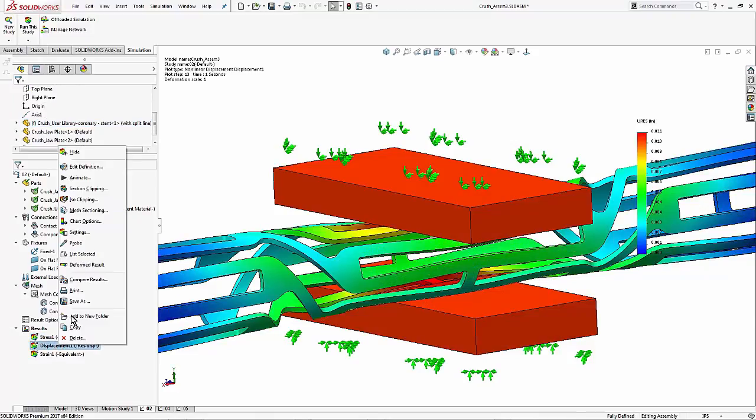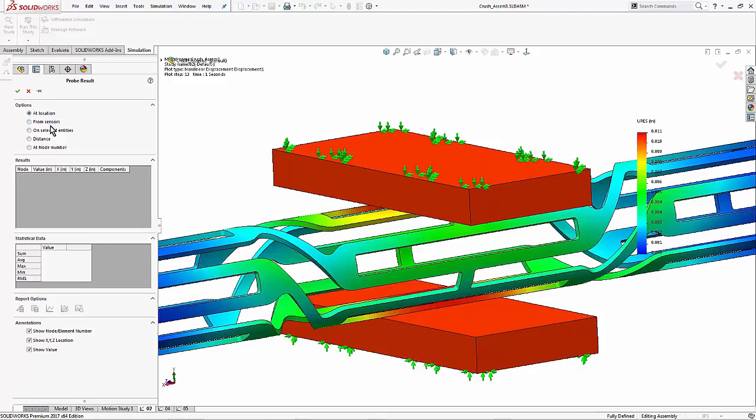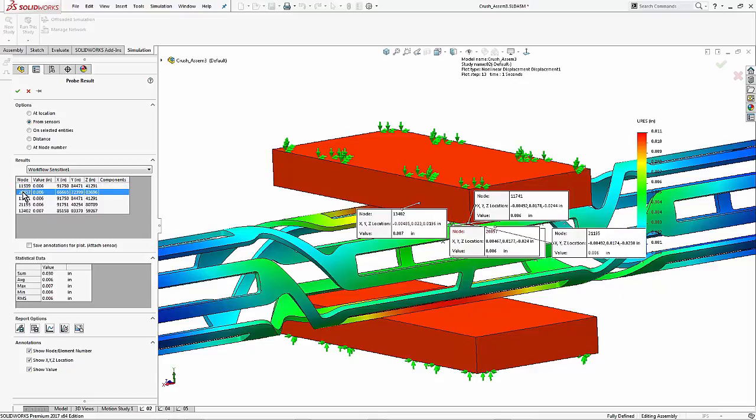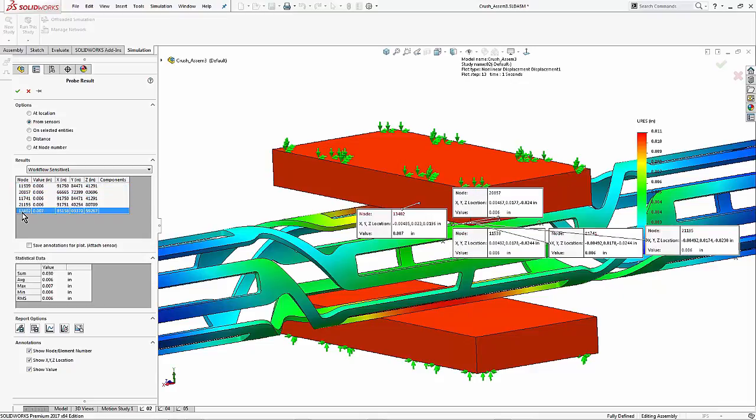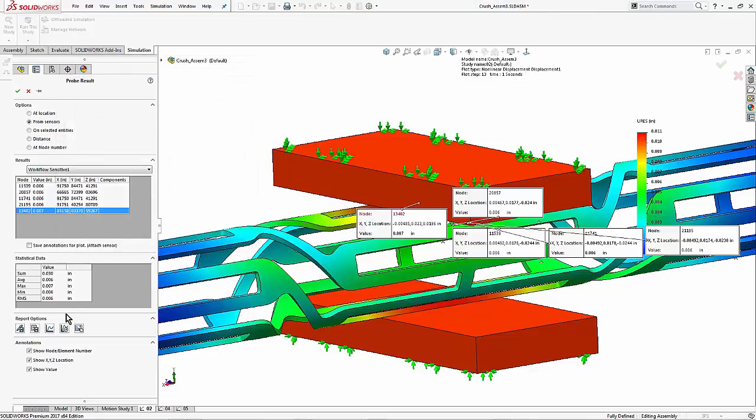As I go back to probe, I'm going to see from sensors and be able to pick the sensor I just created with the displacement results now at those 5 nodes. These probe results can be plotted. They can be exported to Excel. But essentially this is the way that I get numerical data.